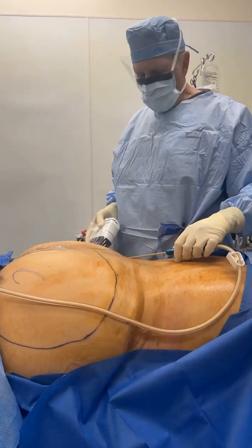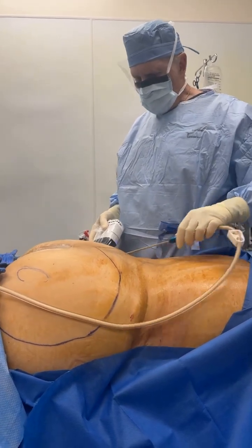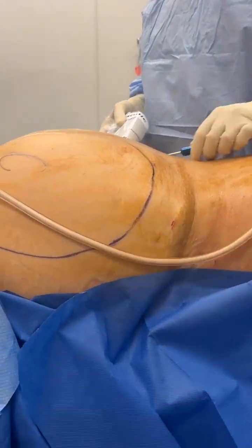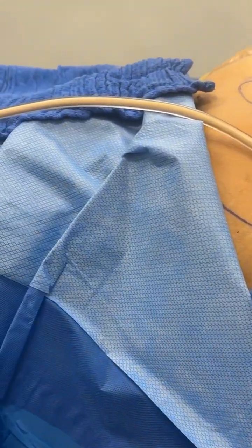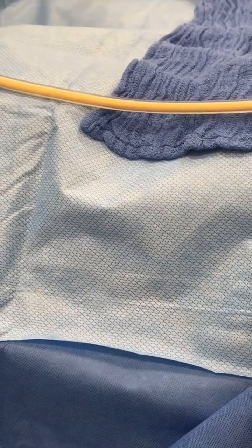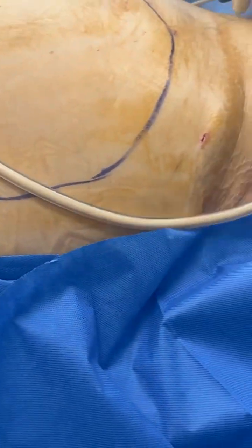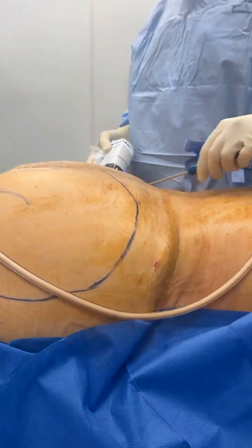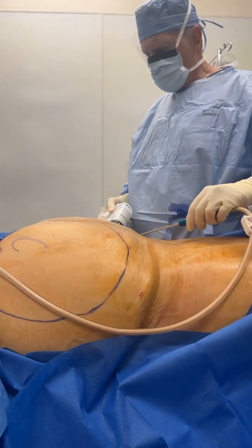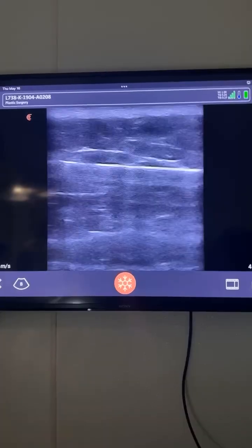Thank you. Okay, so this is ultrasound guided gluteal fat transfer. Look at that fat graft. Wow, what color is that fat graft? Yellow. This is just incredible. So this is the fat that we collected, and it has not been treated in any way. This fat graft was collected in 500 ml of normal saline, and is being placed in the subcutaneous space under ultrasound guidance. Thank you.